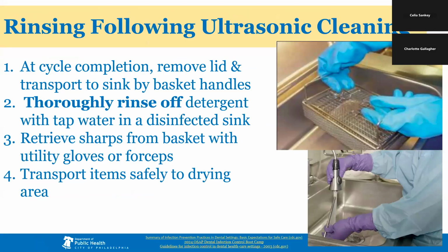After a cycle completes, remove the entire basket, place it in the decontamination sink, and thoroughly rinse detergent off with tap water. Sharps should be retrieved or handled with forceps and utility gloves. Then transport items safely to a clean drying area.